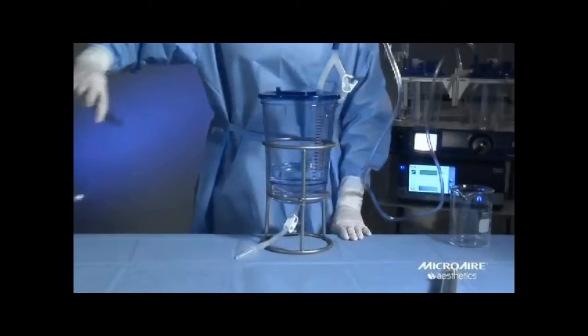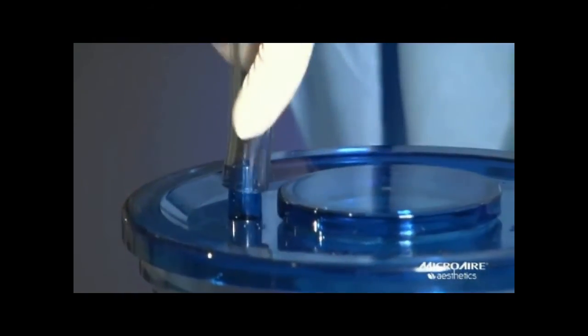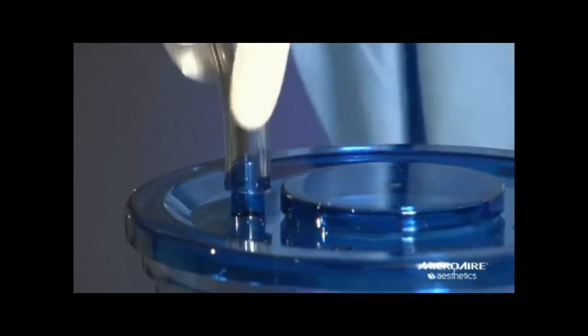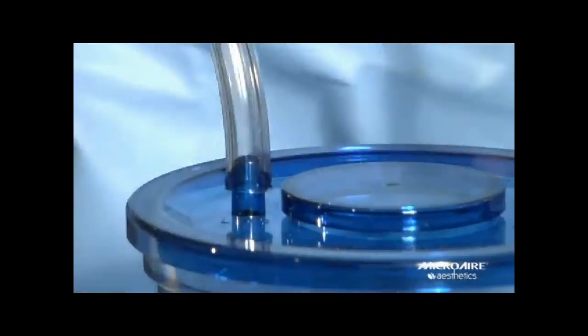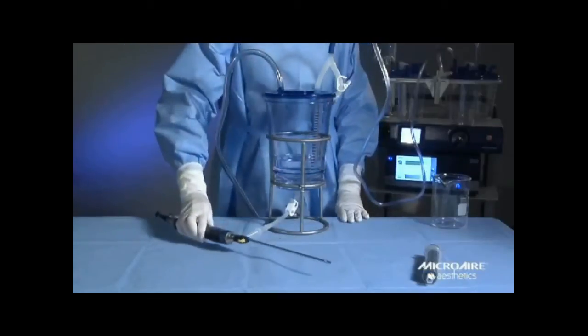The waste canister connects to your aspirator. Connect your harvest tubing to the lipo port. This port is designed to work with your pal tubing or conventional tubing. Connect the other end to your pal handpiece or your manual cannula.